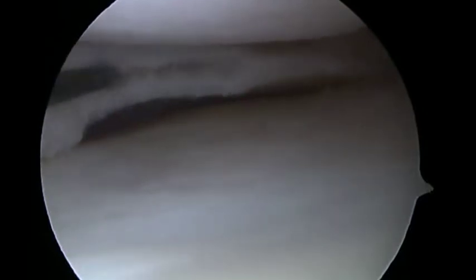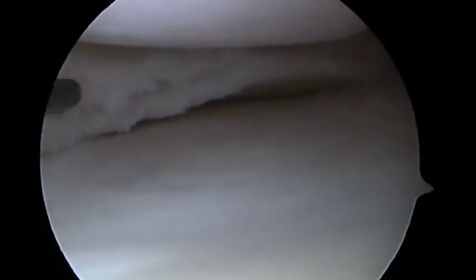Normal meniscus will not separate when tension is applied with the probe. This will allow easy identification of the anterior and posterior margins.